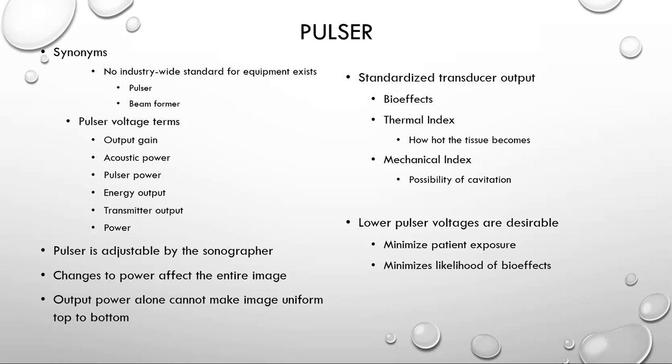We always want to minimize patient exposure, and that means we always, if we can, turn down the voltages, the output power, to a minimal amount. This is going to minimize the likelihood of any bioeffects. So in general, you always want to use less power and more receive gain if possible.